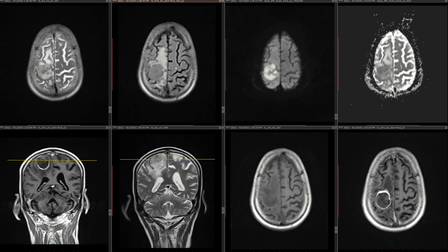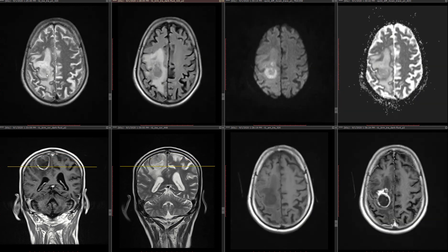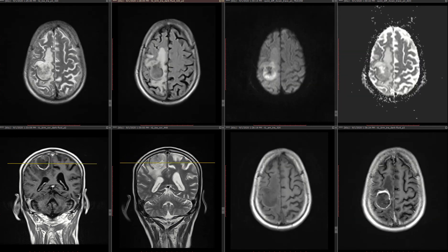I have an interesting case for you today. The patient presented with left leg weakness — that's the only symptom. Basically, what we have here is a T2 hypointense lesion with a lot of vasogenic edema. I'm calling it vasogenic edema because it is not restricting — that edema is not restricting.